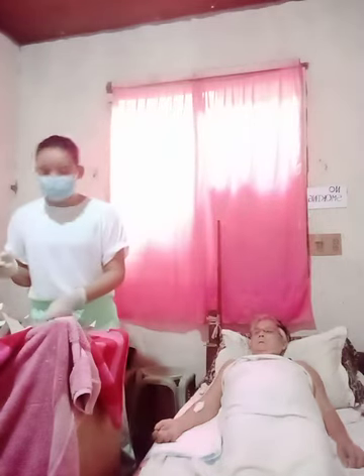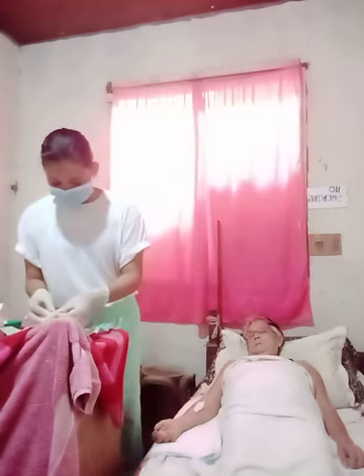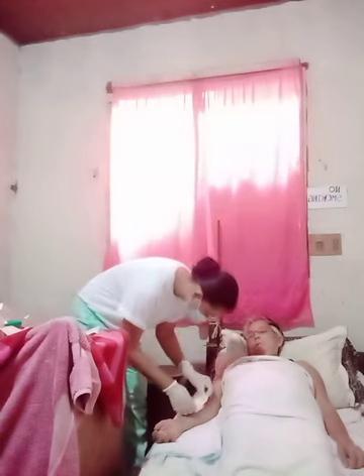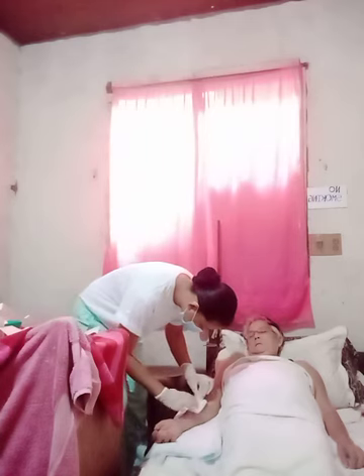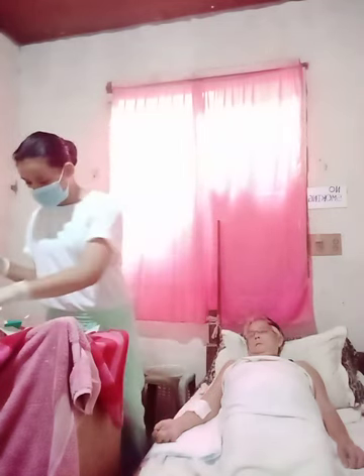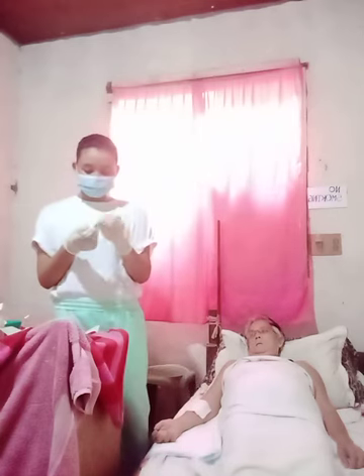Then apply dry sterile 4x4 gauze over the wet gauze. Then apply tape over the dressing. I'm going to pull this, not yet done.